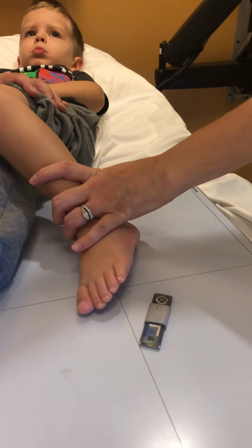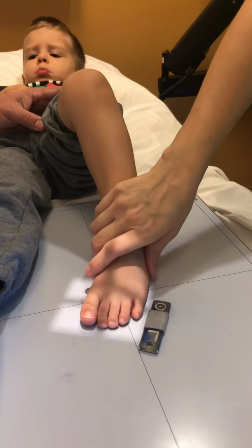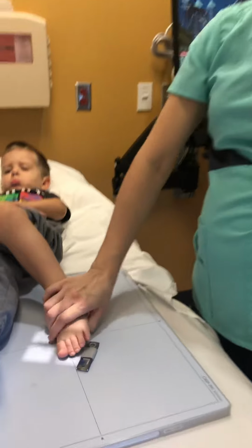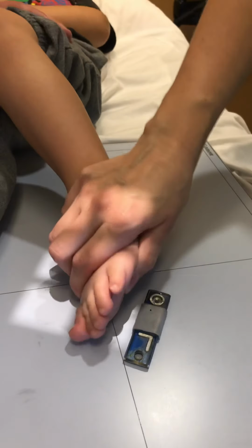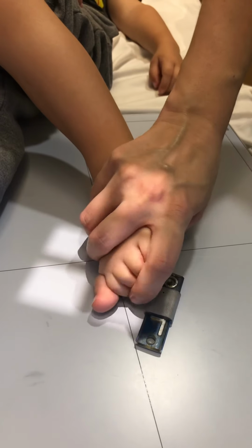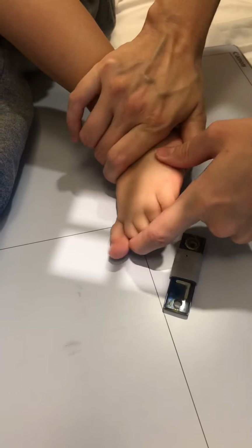So now when you get to the lateral, it depends on the toe of interest. If it's your great toe, your second, you would turn them in or medially and try and retract the toes back. Okay, because you want to try and get that single toe in view.